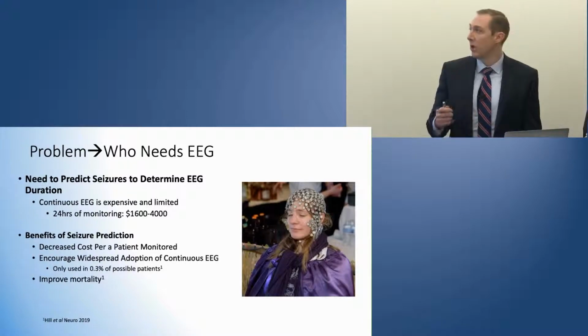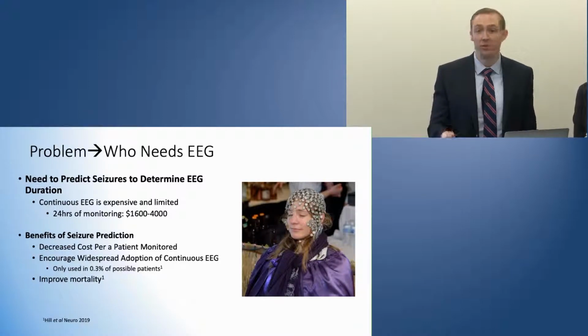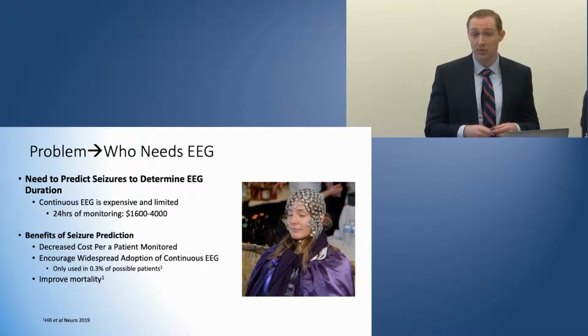So what is the problem? So this is an EEG. So you need to have a continuous EEG on to be able to capture these seizures. But EEGs like this are quite expensive, and even more than just expense, the skill set to be able to interpret them is not very common, even amongst physicians at tertiary care hospitals. And even more limiting are the technologists and the equipment, so the people that actually perform the tests. There aren't many of them. The labor market's very tight. It's hard to train and get enough of them.